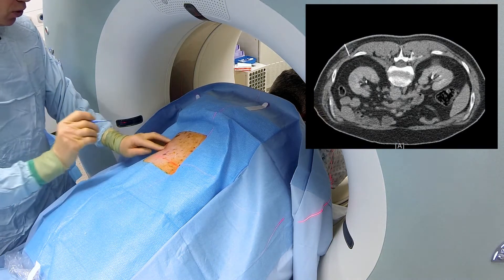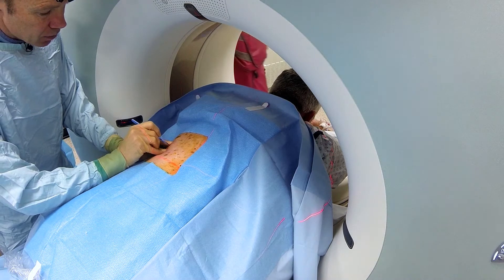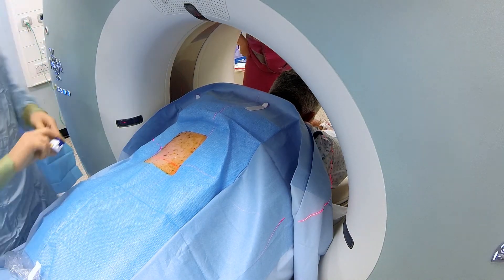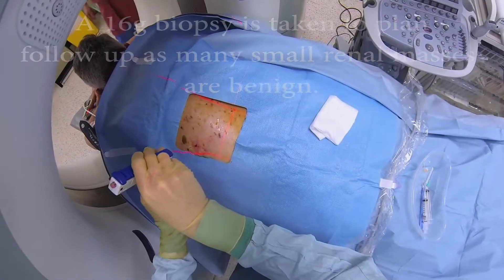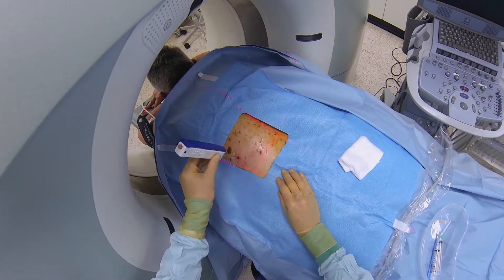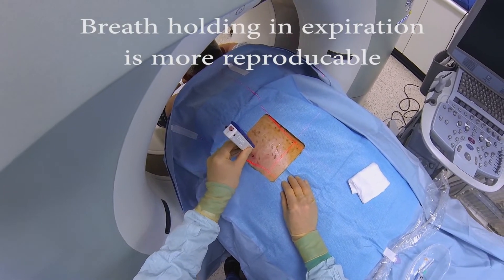Now we're just going to make a small little nick — does that feel sharp? Okay, now we're going to set up to do our biopsy. Just breathe in for me, breathe out, stop there, breathe gently.